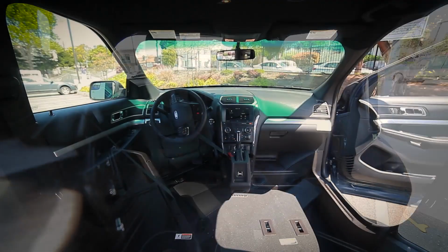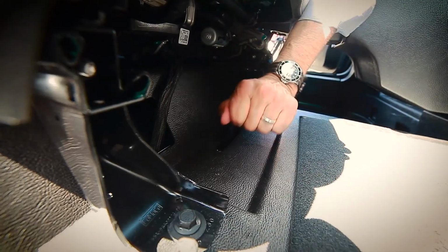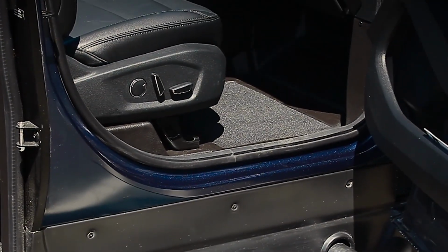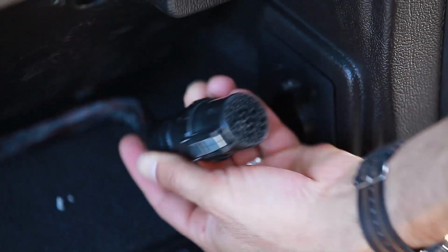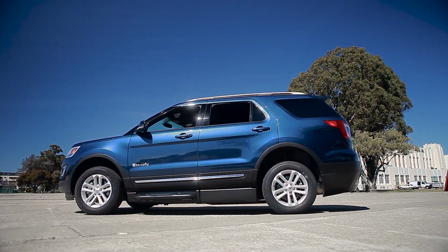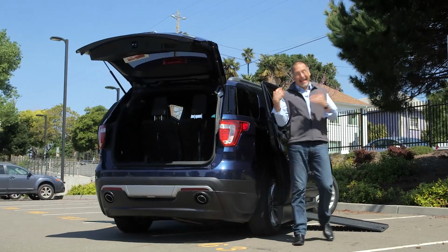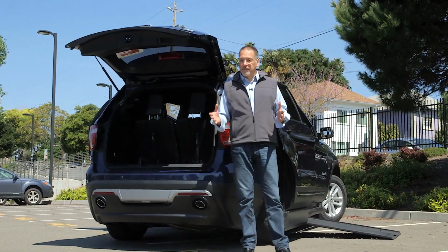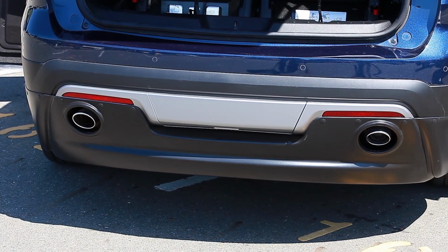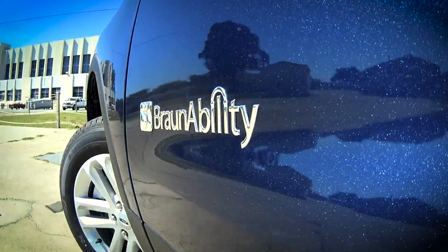The front seats in the MXV aren't too far from 007's Aston Martin, but they don't eject up, they just come out. Unlock this, rotate this, and you wheel them down the ramp. And when they are in the vehicle, they retain full power adjustment and their airbag function thanks to an impressive wiring harness. The MXV is only available in front-wheel drive. Once you drop the floor 10 inches, there's no way to get a drive shaft to the back for all-wheel drive. Now, as you can see, the MXV is obviously a side access, a side door vehicle. You do also see accessible conversions that are rear access from the back here, and those are almost always minivans, of course. If you do that, however, you do lose what this vehicle has: continued ability to tow. It retains its 5,000-pound towing range.